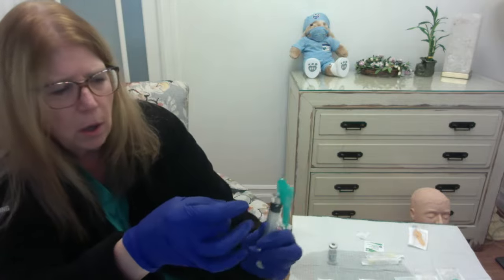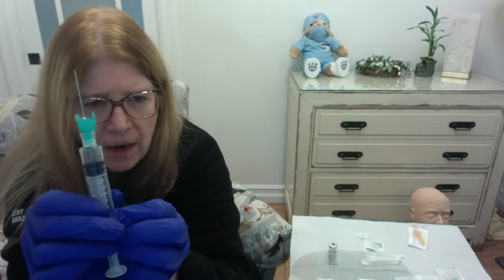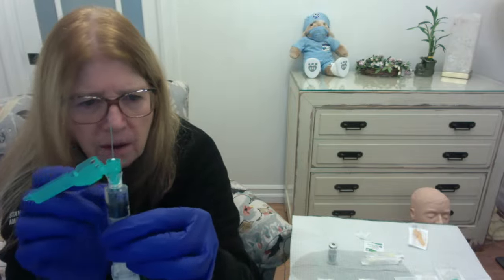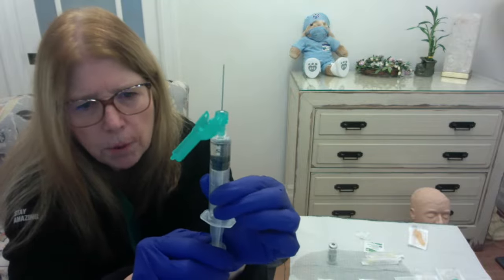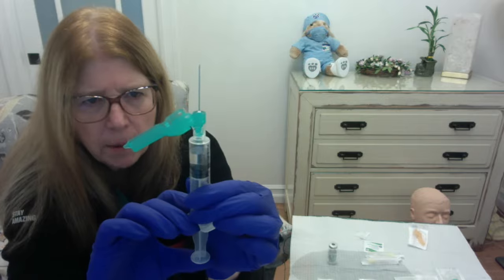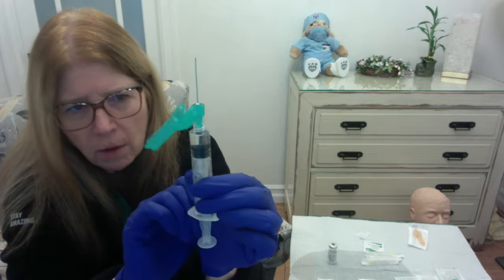If that doesn't work, you can do this whole flick method, and now you're going to see that along the bottom, that air bubble is gone. So I'm talking about down here, right? That air bubble we had before is gone, but my air bubble up at the top has gotten bigger. So here's what I'm going to do. I'm actually going to pull the plunger back a little bit. I'm going to put more air in there, and then I'm going to hold this perfectly level, and I'm going to start moving up my plunger very, very slowly until I have expelled all of the air.